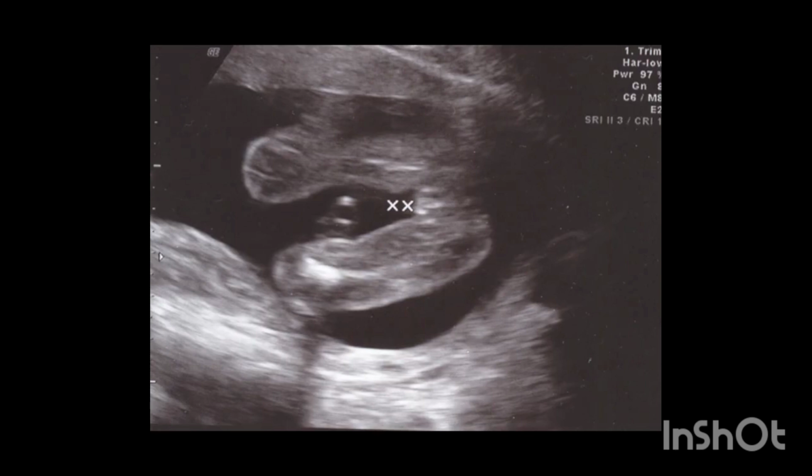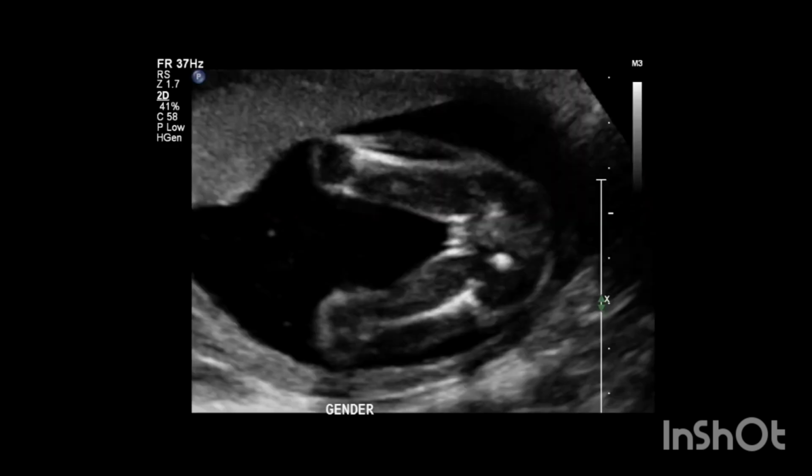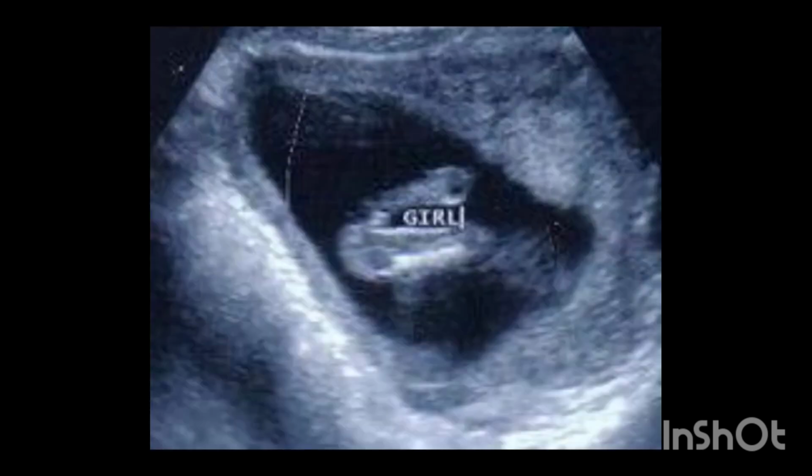As technology advances, seeing the vulva, clitoris, and labia are taken to indicate a female fetus. Seeing the internal pelvic structure of the fetus, including the uterus and ovary, is also used to help identify the fetal gender. There is a substantial chance of getting a false negative diagnosis if the ultrasound imaging for fetal gender identification has been performed in the first trimester of pregnancy.